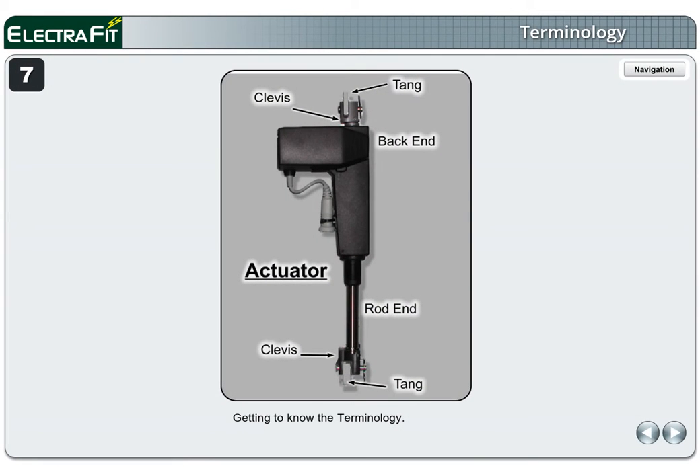Page 7. Getting to know the terminology. The large end of the actuator is referred to as the back end and the opposite end is referred to as the rod end. The clevis is the forked metal connector at each end of the actuator that fits into a space referred to as the tang. See actuator label for identification.